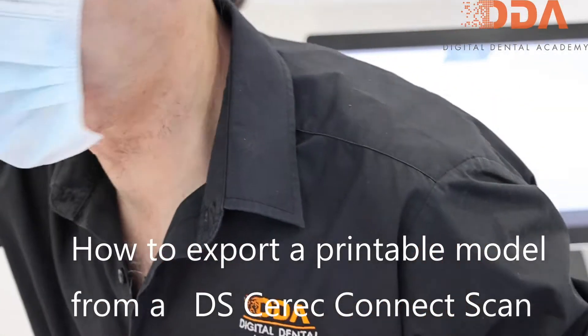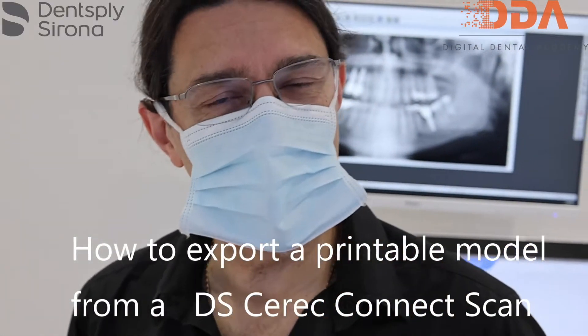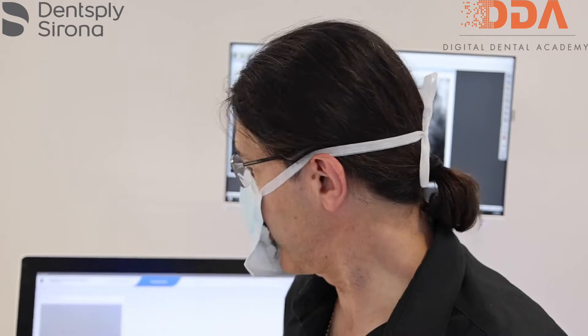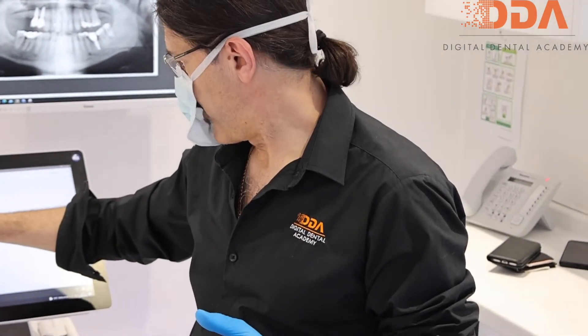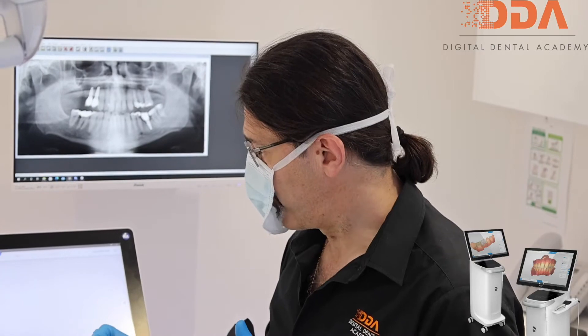Welcome to another IDDA tutorial. Today we're going to show you how we scan, connect, and export a solid model for printing directly from Connect. The libraries we've set up with our patient include the lower jaw, the upper jaw, and the buccal bite scan, which will correlate the two STLs correctly. We're using the PrimeScan today.